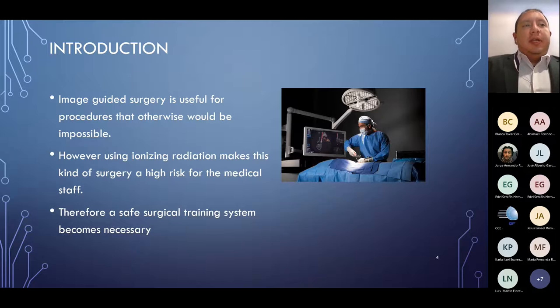The image-guided surgery, and specifically those which use radiography-based images, can be useful to perform processes that otherwise would be really difficult or even impossible, because they allow, as I say, to see inside the bones, to see what actually cannot be seen, like this surgery. The process can also be summarized as taking a shot, showing the current situation, usually the drilling process, then the tool position and orientation, and then the surgeon makes a move and takes another shot, and the process repeats itself until it's finished.